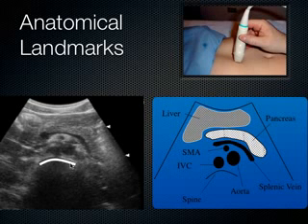the spine shadow. And the spine shadow looks like this, that little spine shadow there, and I know just anterior to the spine shadow and slightly to the spine shadow's left is the aorta. And to the right of the aorta would be the IVC, exactly right. And this very thick walled structure that surrounds this circle looks kind of like a mantle clock sometimes. That's the SMA. And then this little worm that's crawling over the SMA, splenic vein, okay?